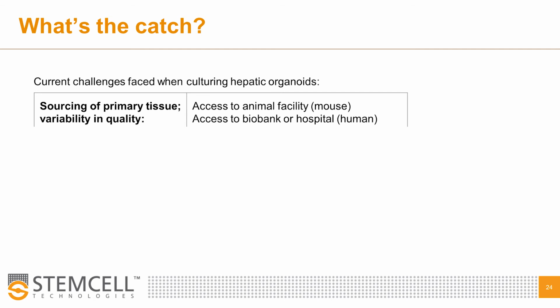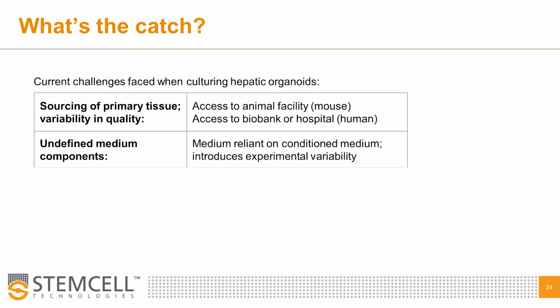If tissue cannot be obtained, sometimes cryopreserved organoids can be requested from labs that do have access to primary tissue, but this process is typically more straightforward in the academic sphere than for biotechnology companies that are looking to start an entire organoid culture program. It goes without saying that accessing and working with murine and adult human tissue is regulated and needs to be approved by local jurisdictions and ethics review boards.